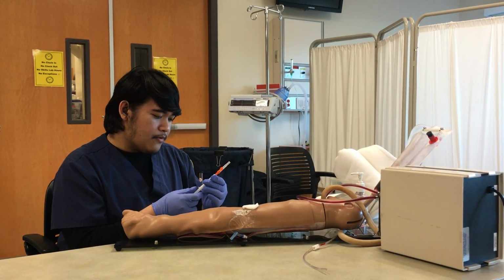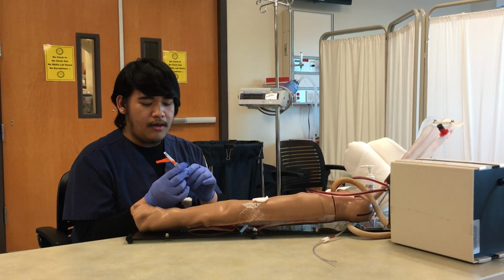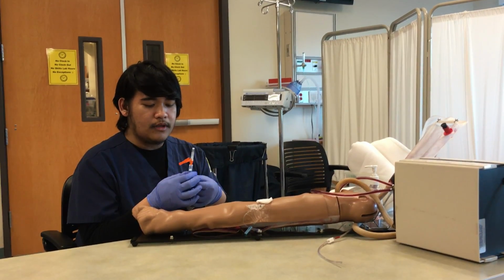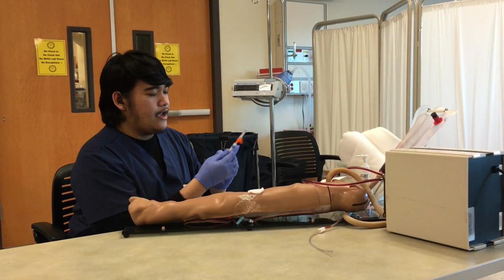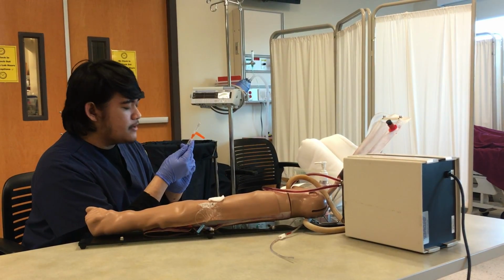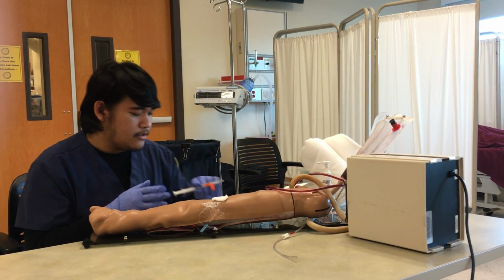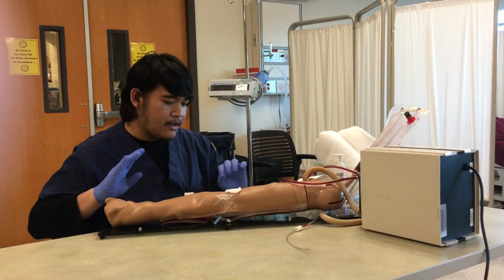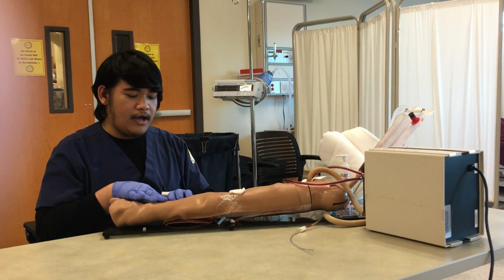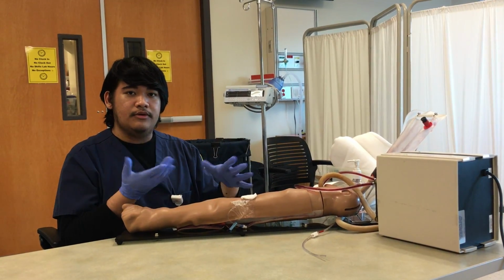We also want to pull air inside the syringe all the way to 1 mL because we need 1 mL for this procedure. Once I've done that, I would check for the site where I want to do the test.